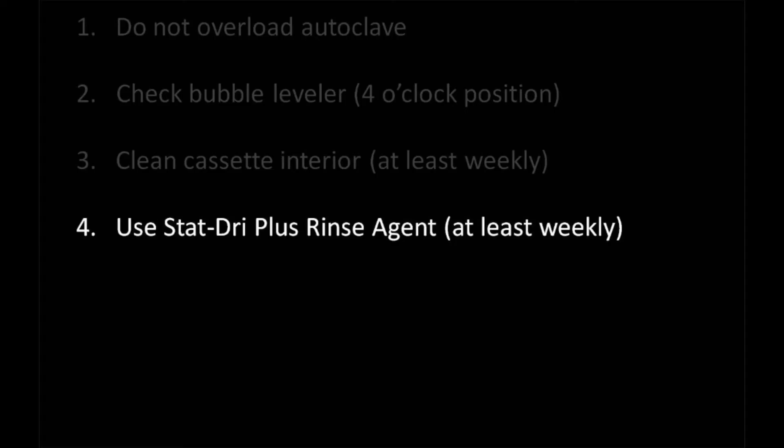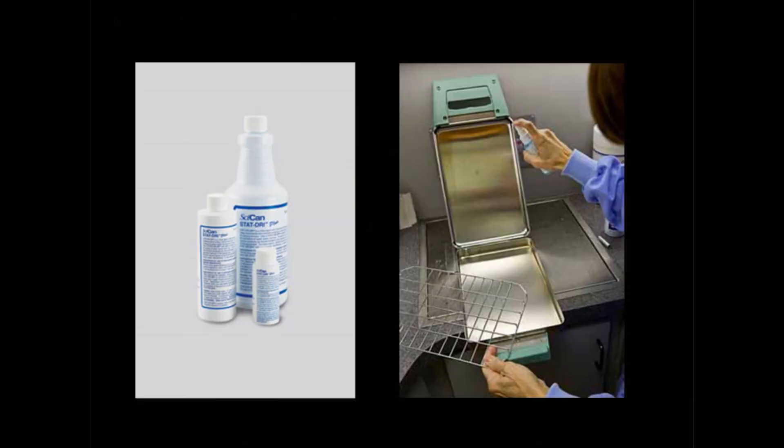Fourth, use STAT Dry Plus Rinse Agent to coat the cassette interior weekly or after cleaning. You will know that the rinse agent is not working properly if you see water collecting on the lid when you open the cassette after ample dry time.